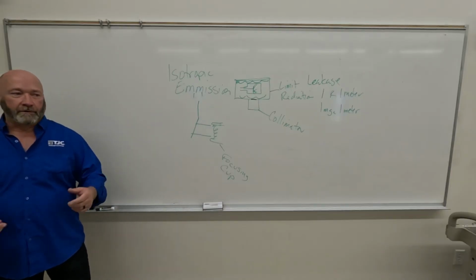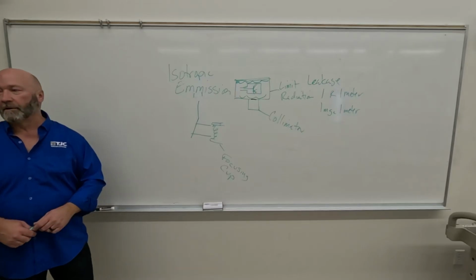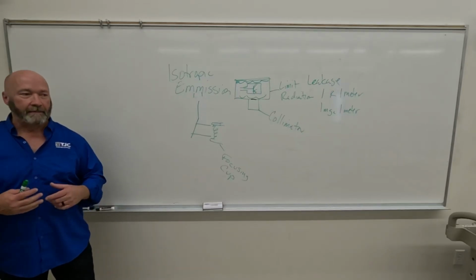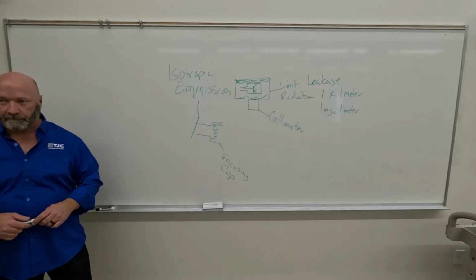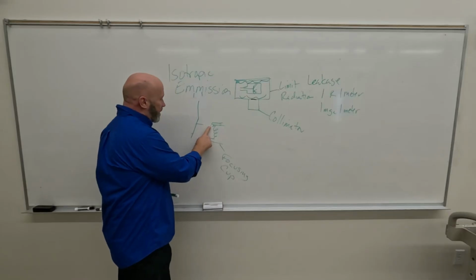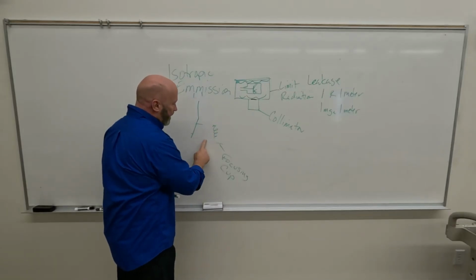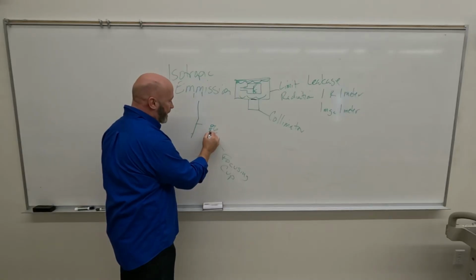Okay, so what are electrons? All negatively charged. So what do you know about electrodynamics or electrostatics? Like charges do what? Repel. Right. So if we take the focusing cup off, and we've got all negative charges, what are they trying to do?